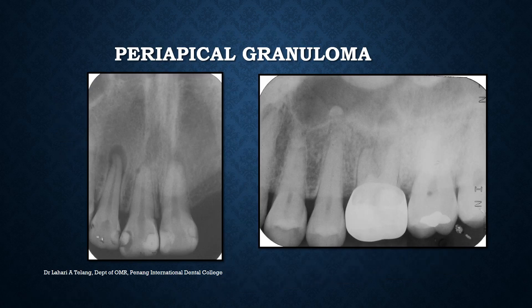Moving on, we're talking about a periapical granuloma where the inflammation is visible in the form of a well-defined radiolucency at the apex of the pulpally involved tooth. Here you can see in this lateral incisor there is a well-defined radiolucency with a very thick sclerotic margin. Similarly, in the molar here also a periapical granuloma is seen at the apex. It must be understood that on a radiograph it is very difficult to differentiate between a periapical granuloma and a small periapical cyst.